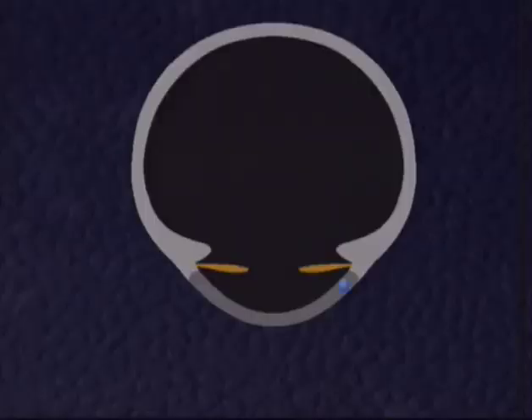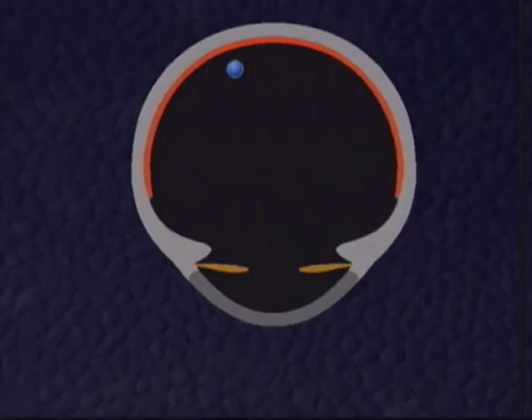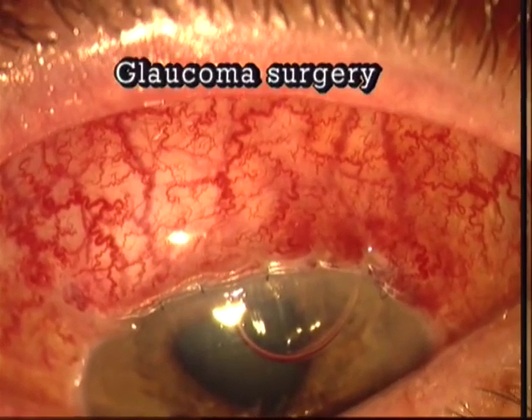Examples of such targets are lesions in the corneal periphery, which are close to the reflecting iris, or targets in the posterior vitreous and the retina, which are close to the reflecting disc or choriocapillaris. To illustrate these phenomena, an exceptional case of glaucoma surgery is shown.